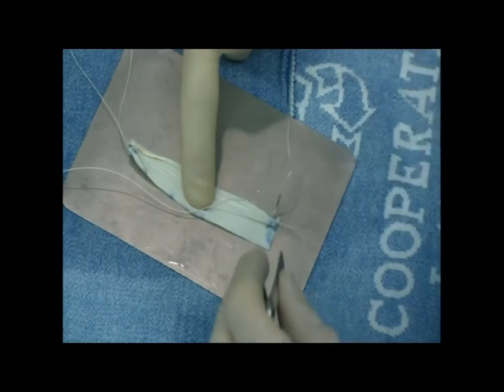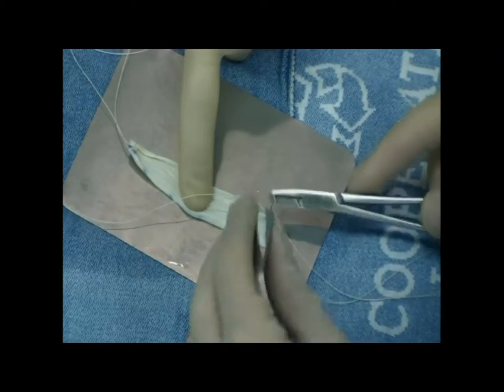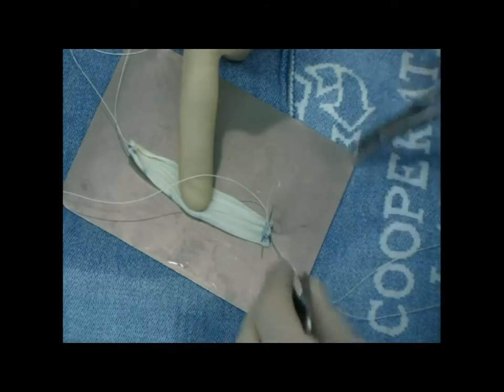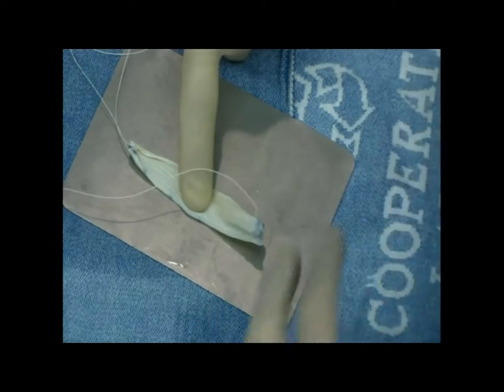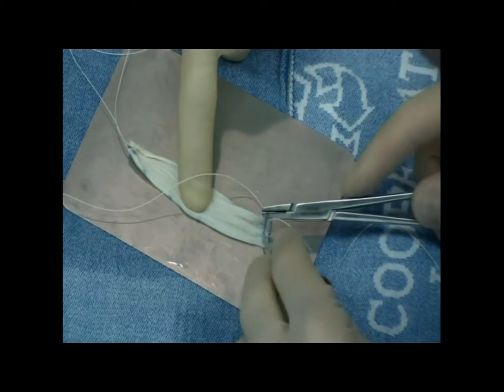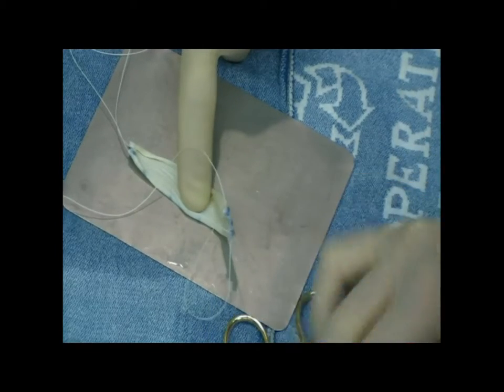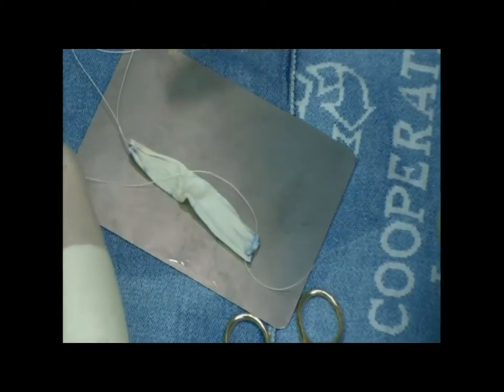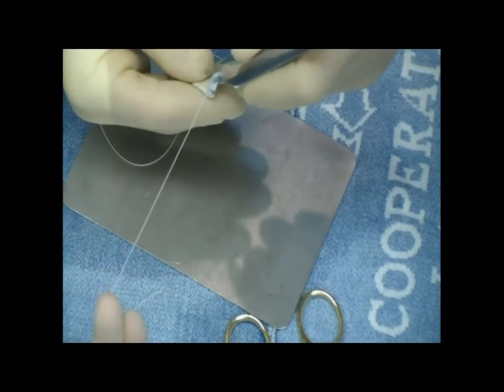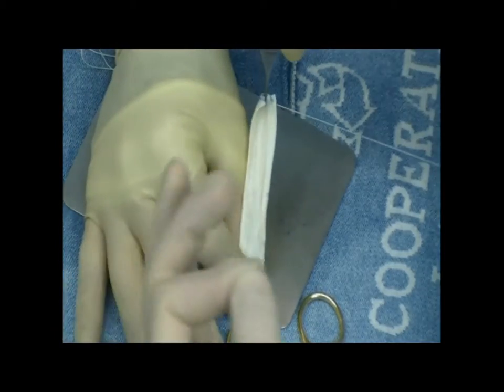This is a 2-0 suture, Vicryl, on an SH needle — a tapered needle so it doesn't cut the graft. We basically just go along the edge of the graft while someone holds the graft in the center and take small bites across. This bunches up the graft when you tie it so that it can then be turned into a cylinder. The way it's held here with the Adson forceps on the edge just helps make it a nice uniform cylinder on the edge.